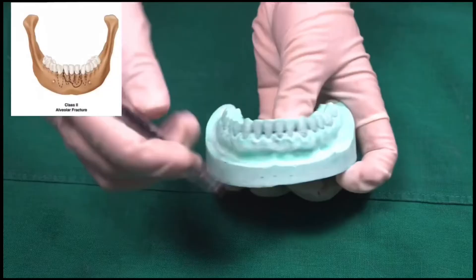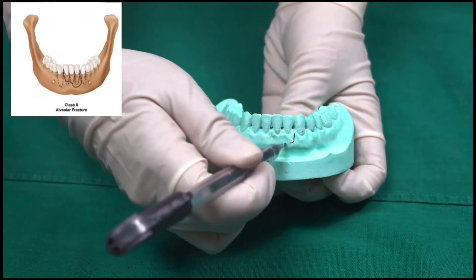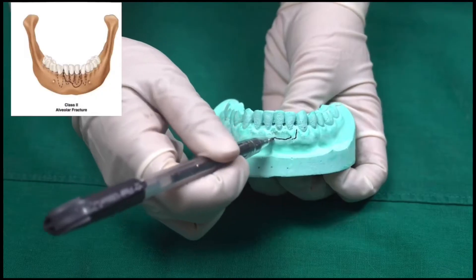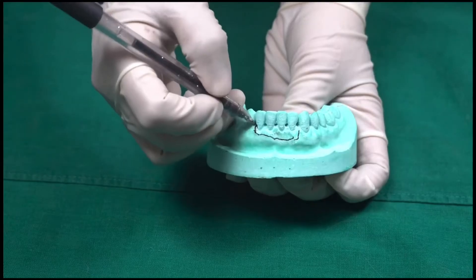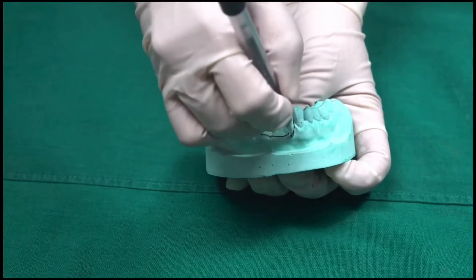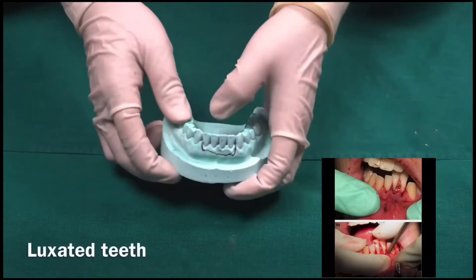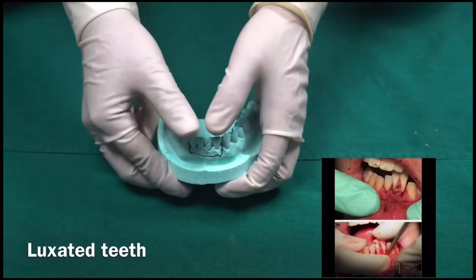Essig's wiring can be used to stabilize the dentoalveolar fracture in individual dental arches. I'll be drawing the fracture line — suppose you have a fracture from lateral incisor to lateral incisor. Essig's wiring can also be used in cases of luxated teeth, where you need to push the luxated tooth apically.